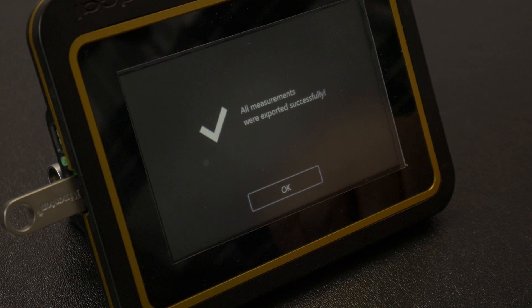The system will automatically export the data to the flash drive and return a message indicating that the measurements were exported successfully. You can now remove the flash drive.